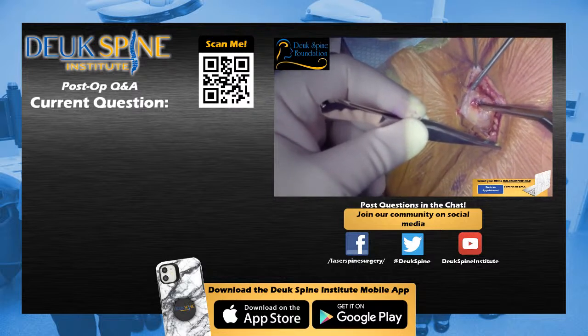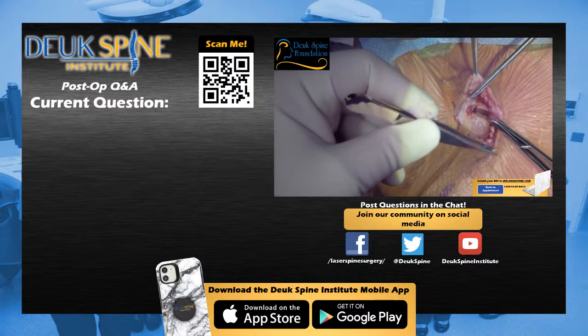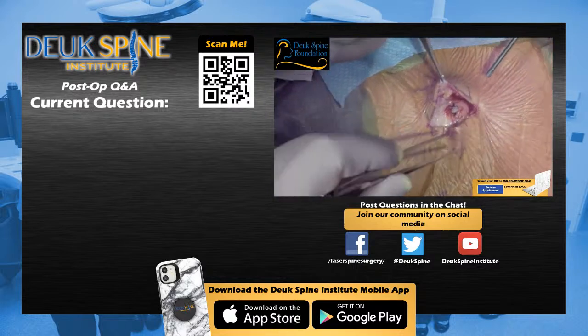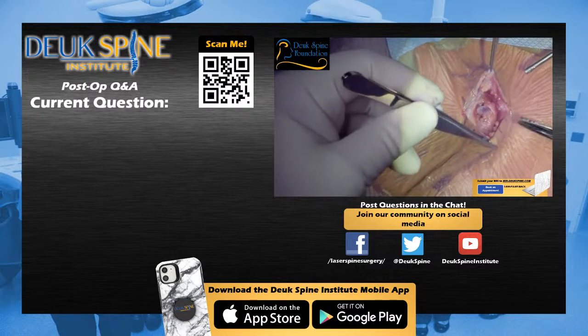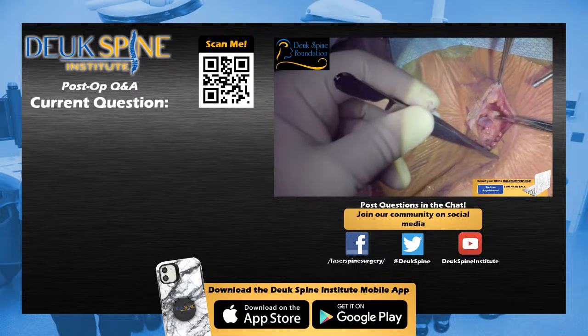Okay, everyone, this was an anterior cervical discectomy and fusion. It's a surgery that's been done, not the same way I do it, but the concept of cleaning out the disc, putting in a spacer, and fusing the bones. This has been done for 60, 70 years now.